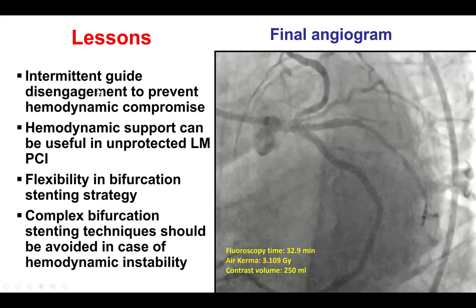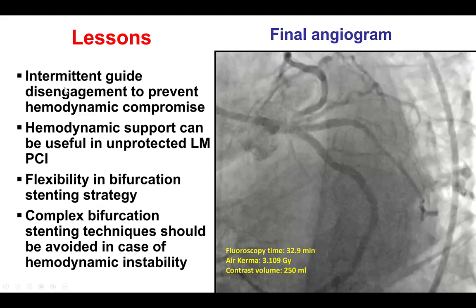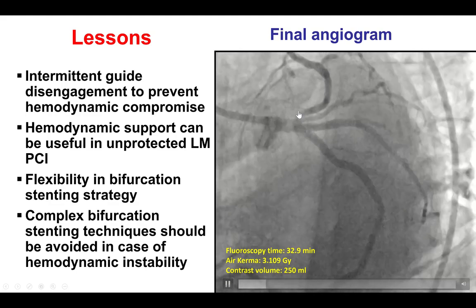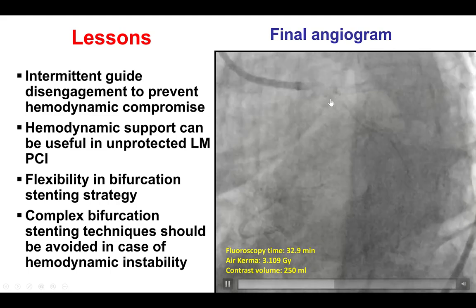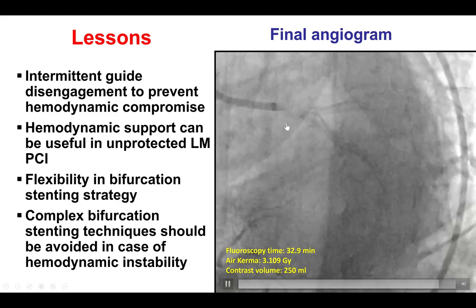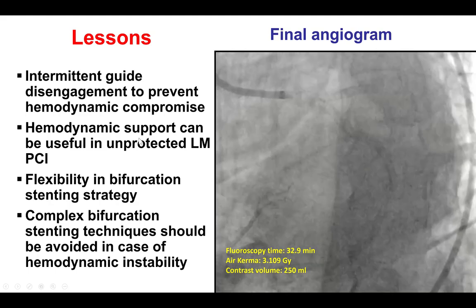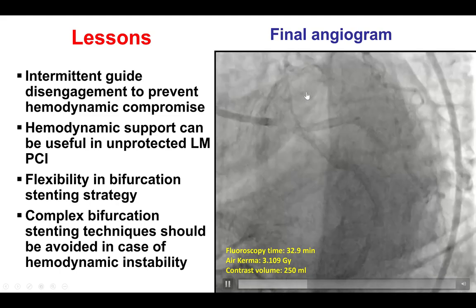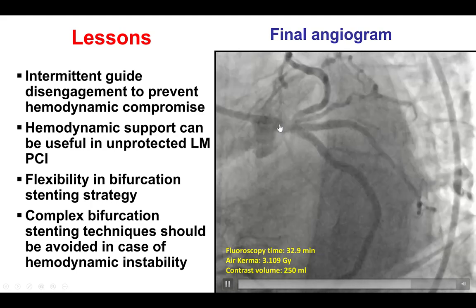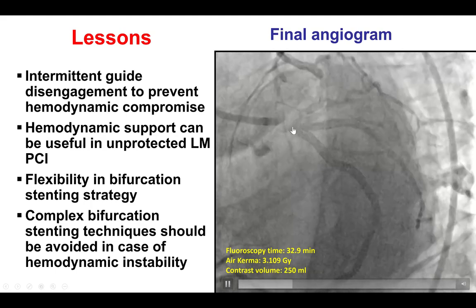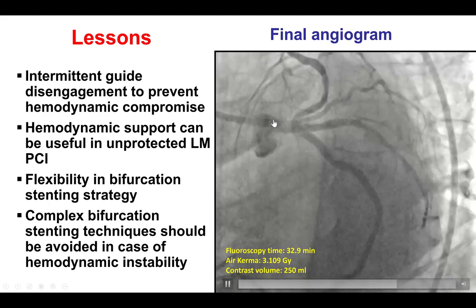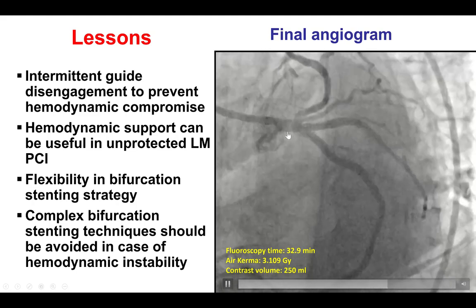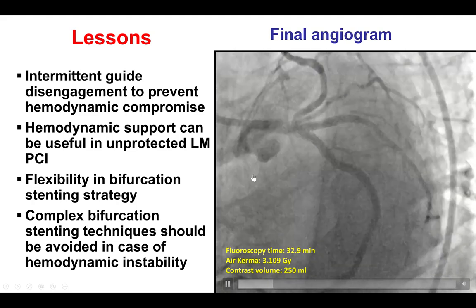Several lessons from this case. First, when treating left main lesions — or any ostial lesion in general — it is important to intermittently disengage the guide to minimize pressure dampening that could result in ischemia, EKG changes, and potentially hemodynamic compromise. Second, hemodynamic support can be useful in unprotected left mains. Here, there was a LIMA graft to the distal LAD, but because the patient had a left dominant system, he did have some transient hypotension. Having hemodynamic support might have allowed more time and stability to perform a full DK crush rather than the mini crush technique we ultimately used.